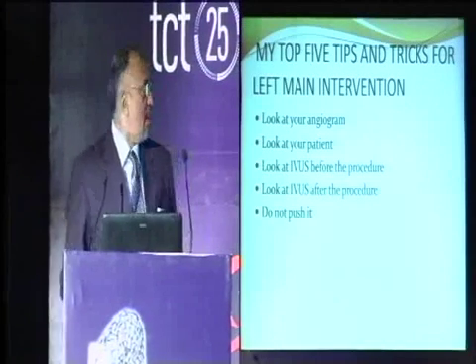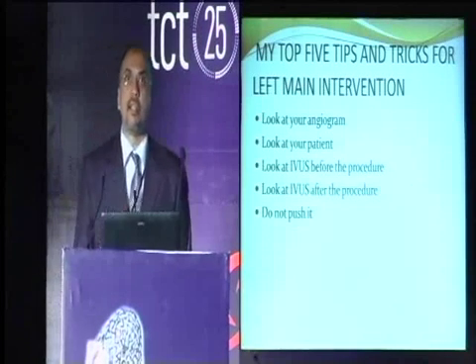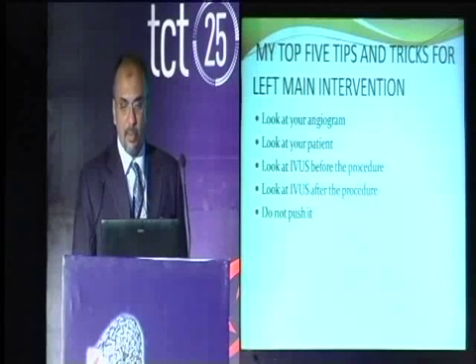I think it's very important to keep in mind, especially this IVUS, because till we got IVUS, we did not really realize how useful IVUS can be. I'll come to that.